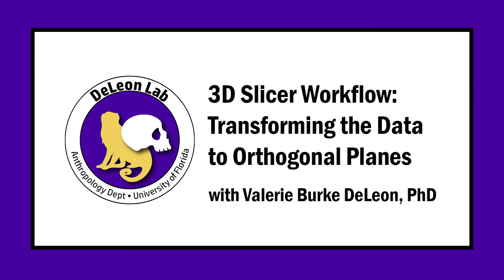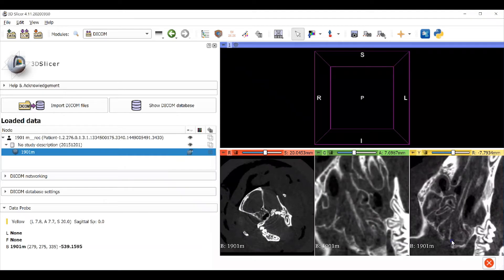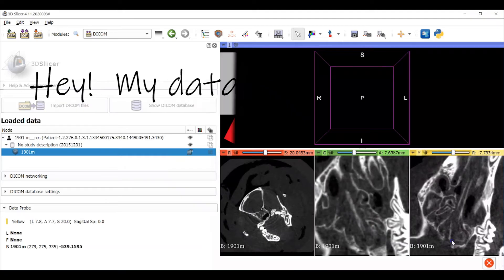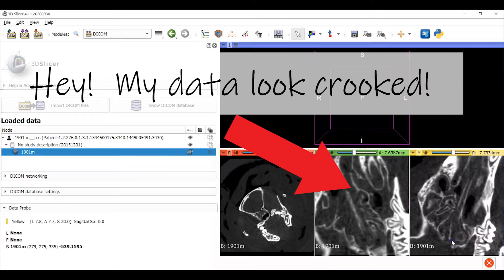This is Valerie DeLeon, and in this video I'll describe ways to transform your image data to fit orthogonal planes in 3D Slicer. Or as we say in the lab, hey, my data look crooked.